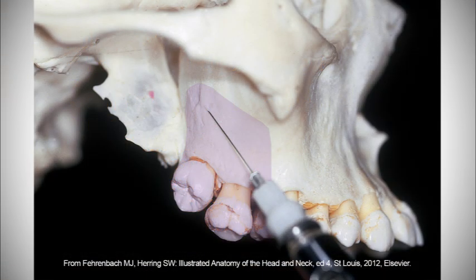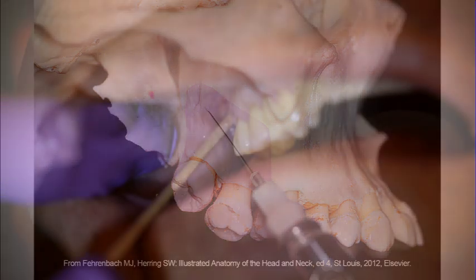The posterior superior alveolar, or PSA block, is used to achieve pulpal anesthesia in the maxillary third, second, and first molars in most patients. Thus, the PSA block is indicated when the dental procedure involves 2 or more maxillary molars or their associated periodontium and buccal gingival tissue.